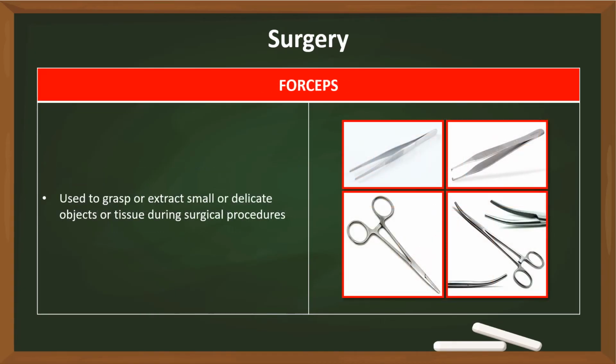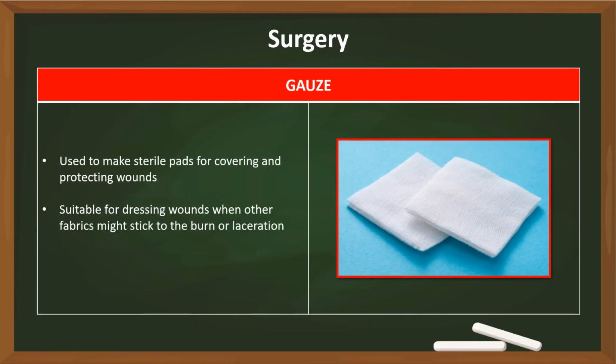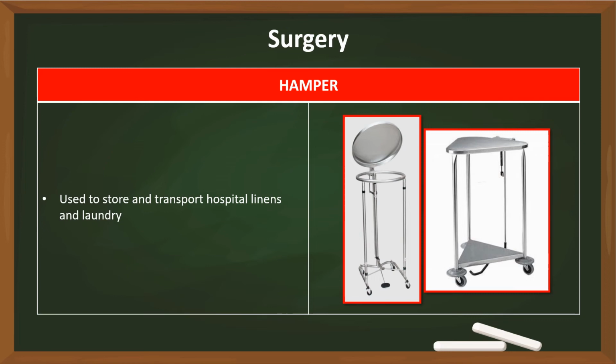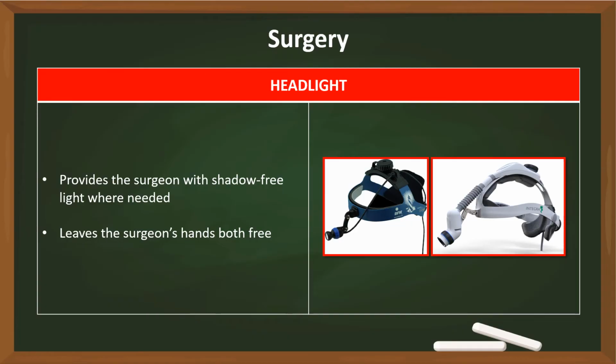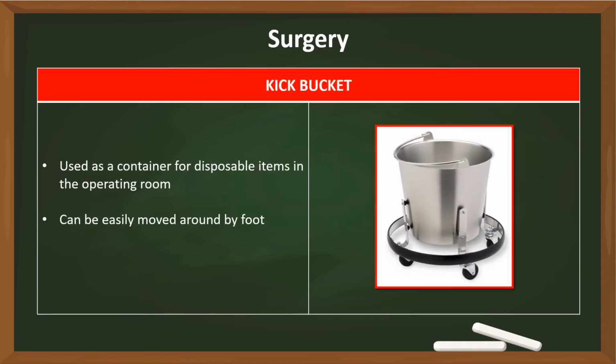Forceps. Gallipot. Gauze. Hamper. Headlight. Instrument tray. Kick bucket.